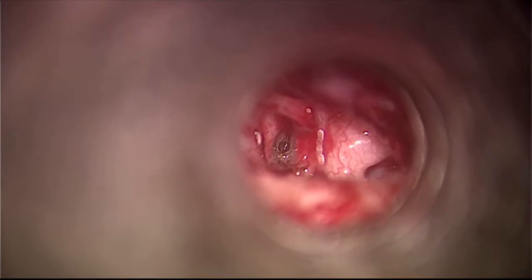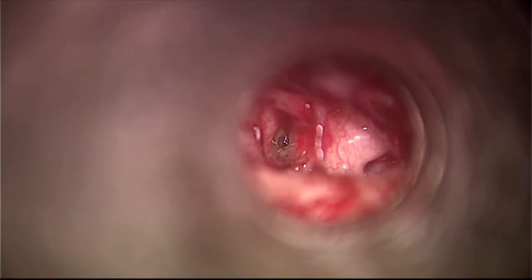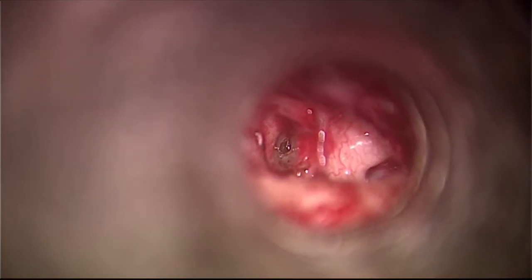One more point: the bubble of perilymph is not broken. Very important that the bubble of perilymph should not break. Now lastly, again to the piston. See the beauty of the piston. It is so simple to apply. It's in your hand. It is really simple in the sense that you don't have to crimp. Yeah, that is one advantage.